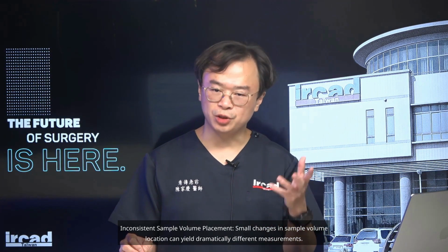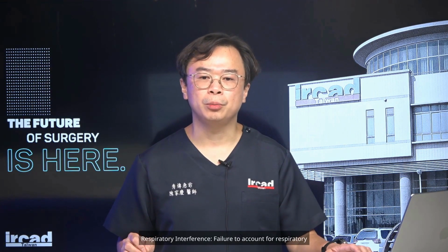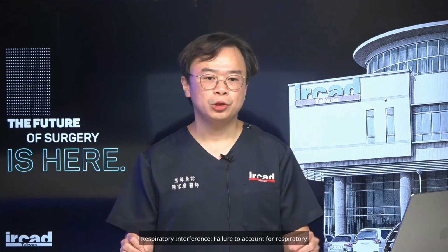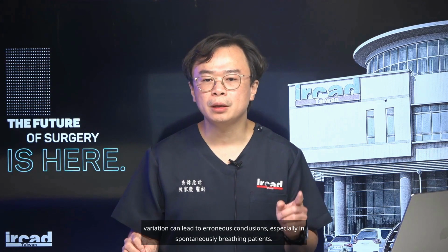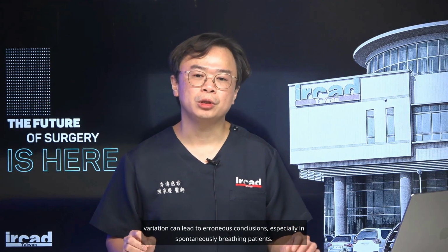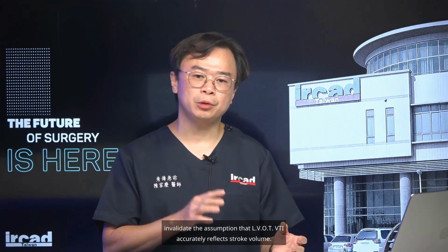3. Respiratory interference. Failure to account for respiratory variation can lead to erroneous conclusions, especially in spontaneously breathing patients. 4. Aortic valve pathology. Stenotic or regurgitant aortic valves invalidate the assumption that LVOT VTI accurately reflects stroke volume. 5. Variability in LVOT diameter measurement.